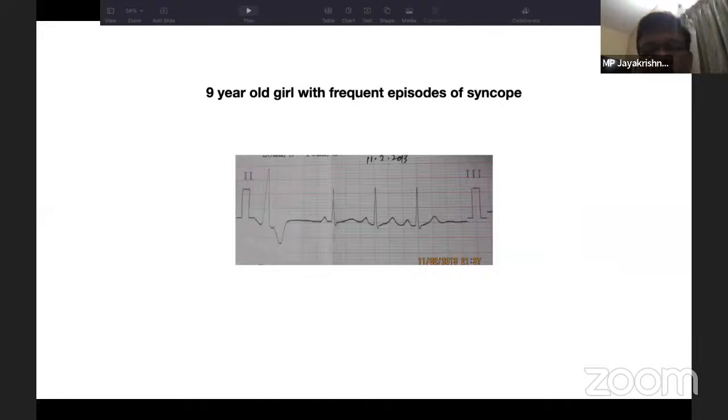Can you see the ventricular ectopic there? I showed you the atrial ectopic and junctional ectopic, narrow complex. But this is a ventricular ectopic, means the QRS complexes are wide. Another thing is there is a T wave of opposite polarity that is following the QRS complex. So this is a ventricular ectopic. There's no P wave preceding also, but this is lead 2.